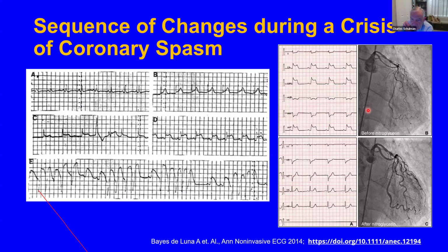This is a good illustration. This is generalized coronary vasospasm. This is during catheterization, generalized vasospasm, and relieved by nitroglycerin, as you see here. This is also to illustrate that with the development of vasospasm, this is actually an example of vasospasm that occurs here. The ST segment is normal, then it starts to elevate more as we're watching it, and then ventricular tachycardia. So it's not always a benign condition. Well, it's not really a benign condition to begin with, but it can be quite dangerous.